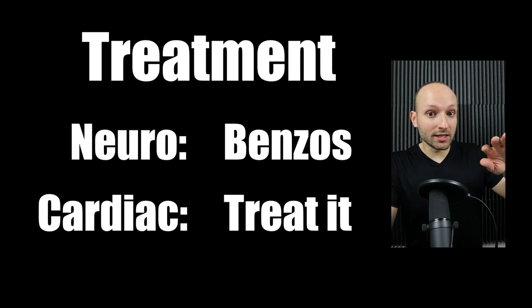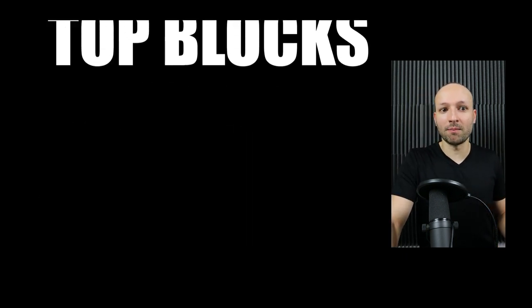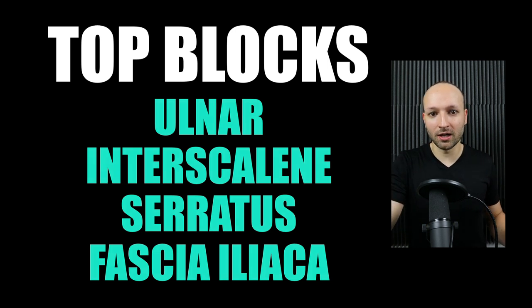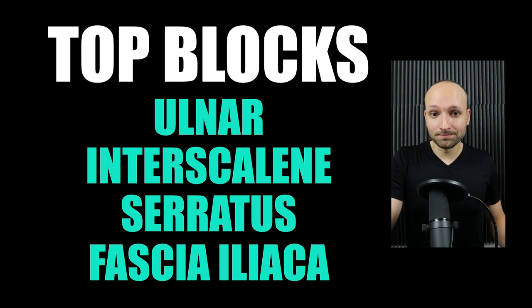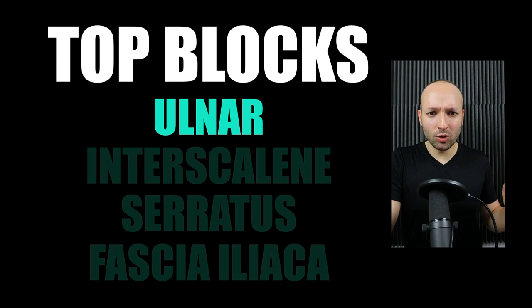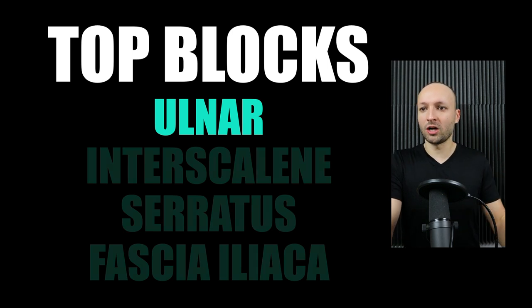That covers the basic stuff. Now let's talk about my top blocks — my favorites are the ulnar block, interscalene, serratus, and the fascia iliaca block. These are my favorites because they're the most common indications I encounter. Let's start with a really good block to begin with if you're less familiar — the ulnar block. It's very simple, easy, a low volume block, and has a low chance for complication.